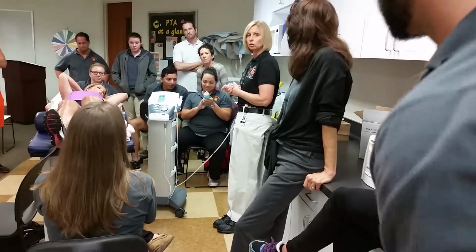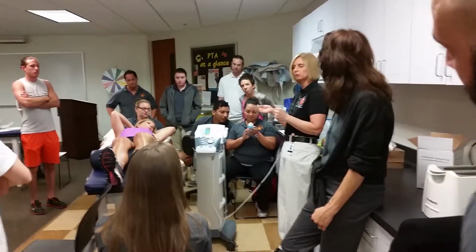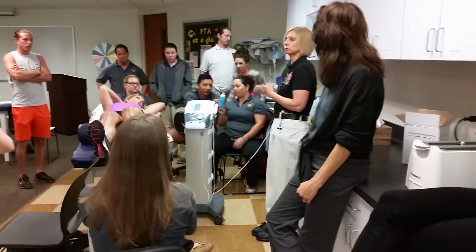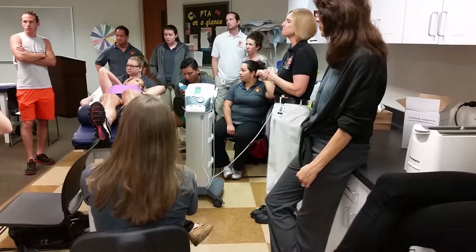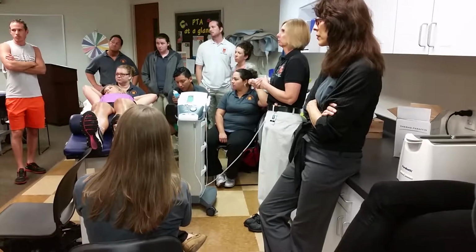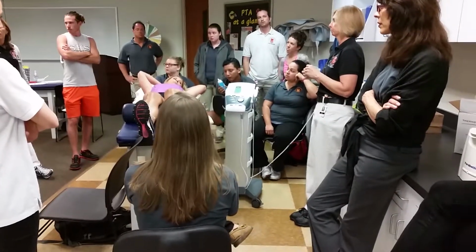I haven't had anyone allergic to it ever. And this is what they use. This is the same basic technology that they use when they look at babies. It's just a different frequency. So any other diagnostic ultrasonic is pretty safe to put on. Is that why it's okay to use some ultrasound for pregnancy, and it's contraindicated here, since it's a different frequency? Yes, it's a different frequency. They're just looking to give an outline of something, where here it's penetrating to those tissues. They're never using it at a thermal level.